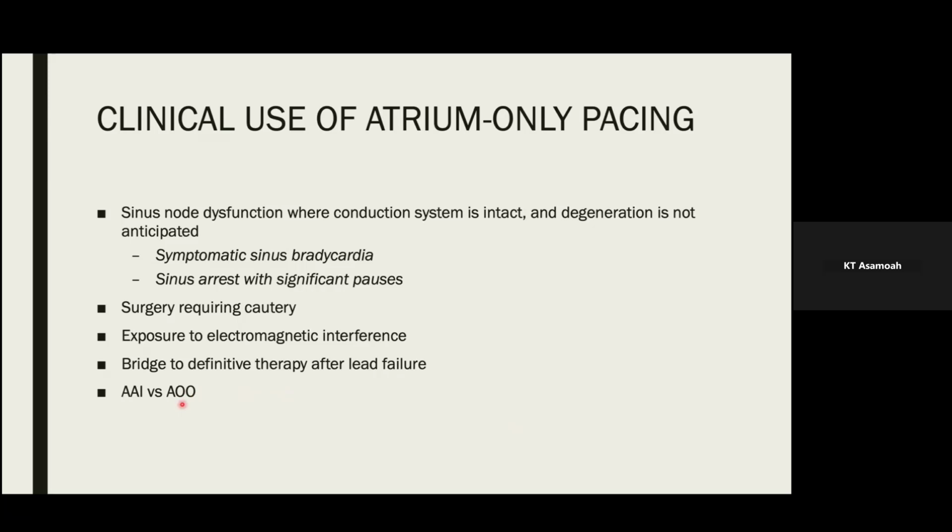Similarly, when there's going to be exposure to electromagnetic interference, like you're going to an MRI, or as a bridge to definitive therapy after lead failure, you can do AOO.